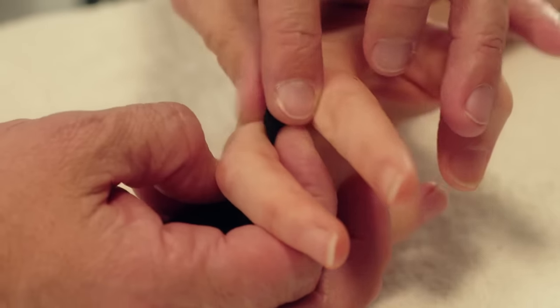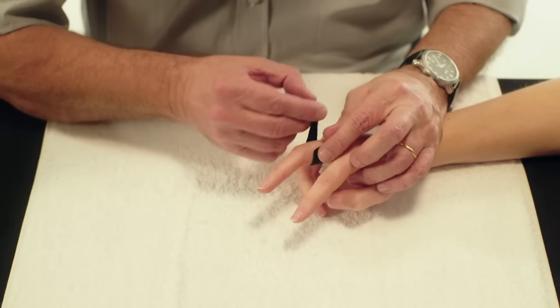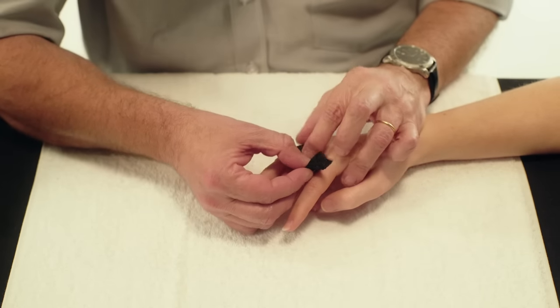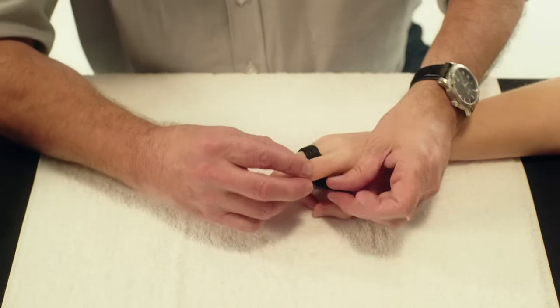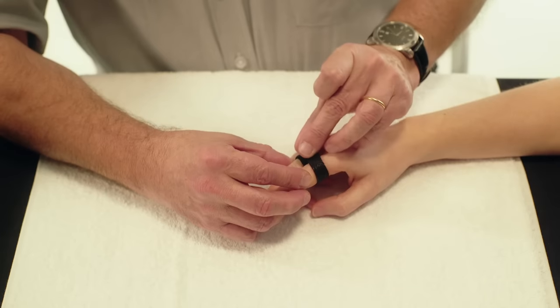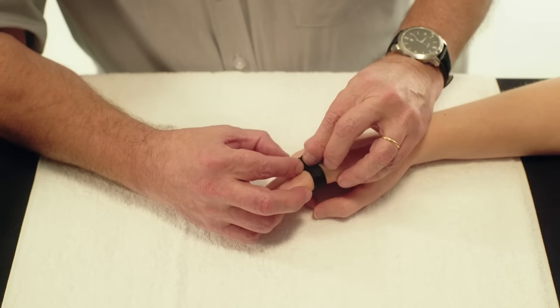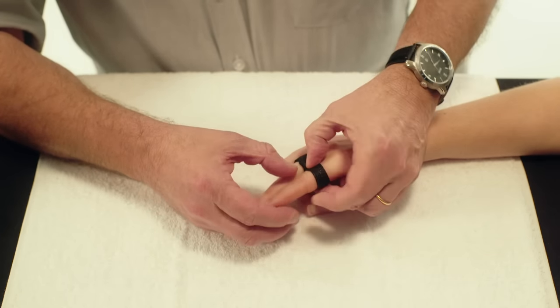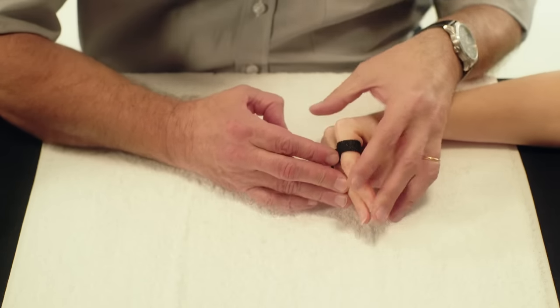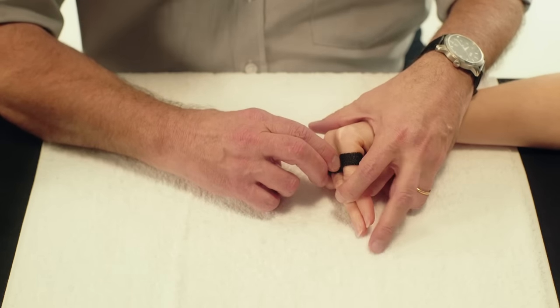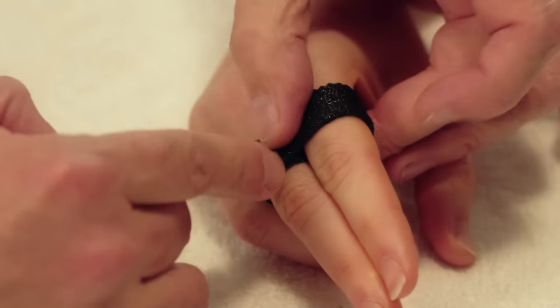Place the end of the Orphicast strip between the two fingers over the proximal phalanx, leaving the PIP joints free. Continue wrapping towards the palmar side of the second finger and pass it around to connect on the dorsal surface of the proximal phalanx to adhere to the Orphicast on the first finger.